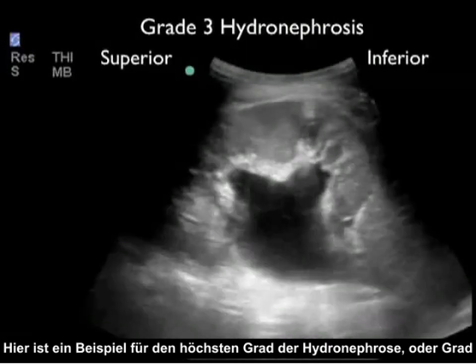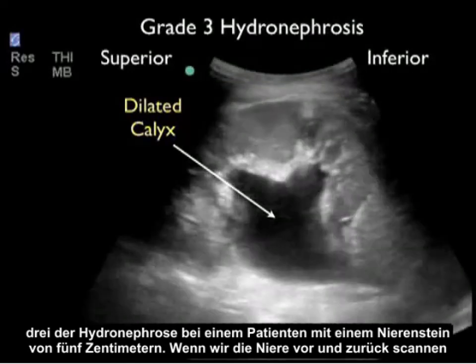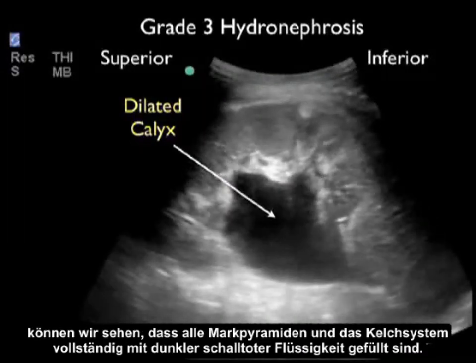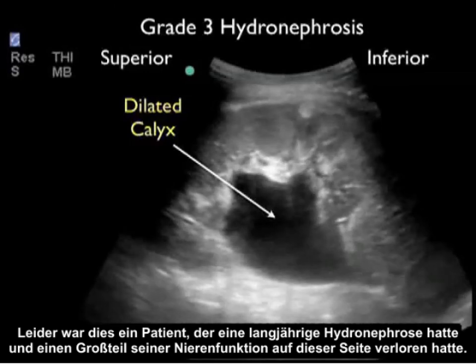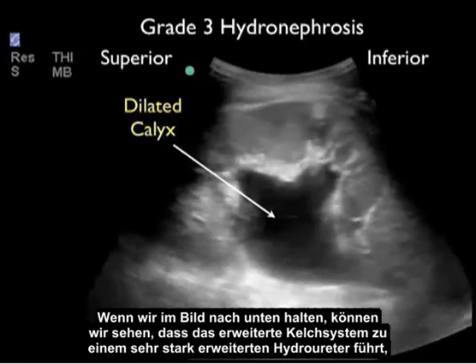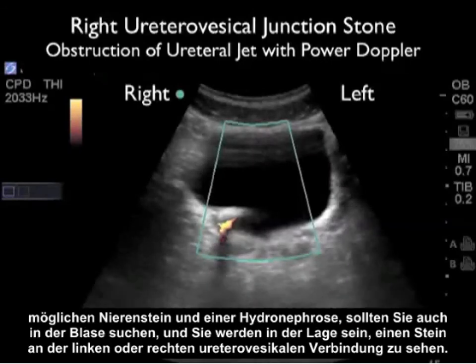Here's an example of the highest grade — severe or grade three hydronephrosis — in a patient who had a 1.5 centimeter kidney stone. As we scan back and forth through the kidney, we can see that all the medullary pyramids and the calyceal region are completely filled with dark or anechoic fluid. All that's left is the outer cortex of renal tissue. Unfortunately, this patient had longstanding hydronephrosis and had lost a lot of kidney function on this side. As we still the image, we can see the dilated calyceal region leading to a very dilated hydroureter, again confirming hydronephrosis.